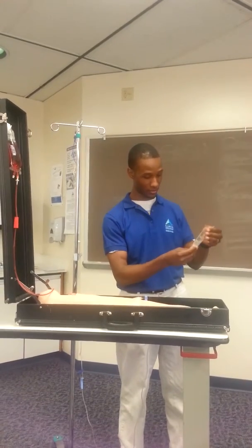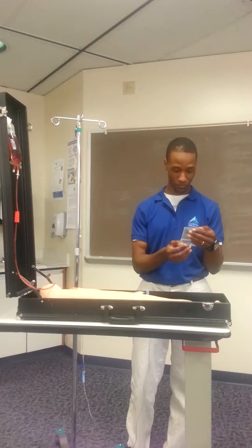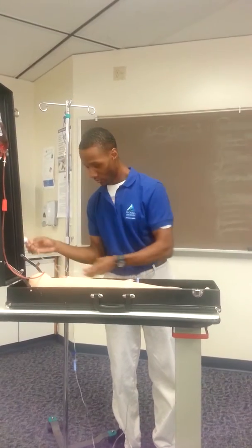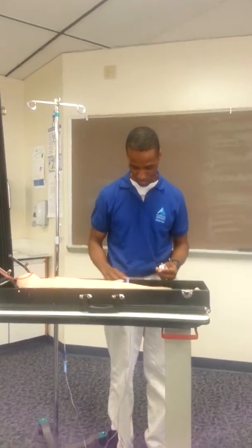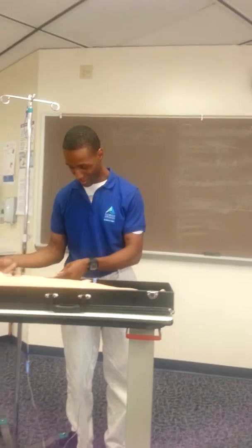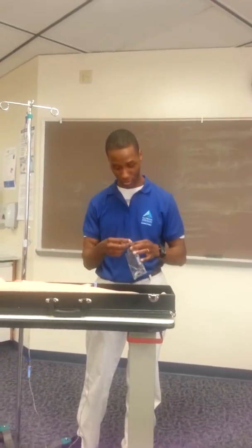So I'm going to inspect my 100 ml bag of saline. Make sure it's normal saline. I'm going to inspect for the expiration date. And I am then going to get my Piggy tubing. Take out the cap. And, excuse me, keep the cap on. Inspect the tubing. I'm going to take my port, clean the tip off with alcohol.